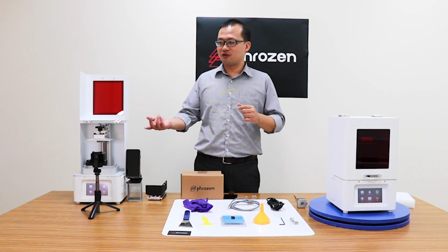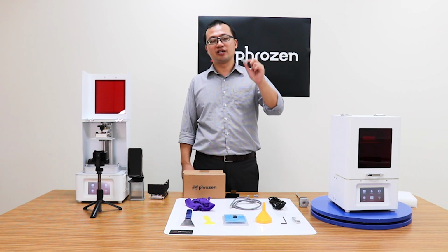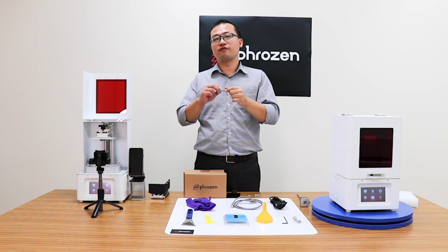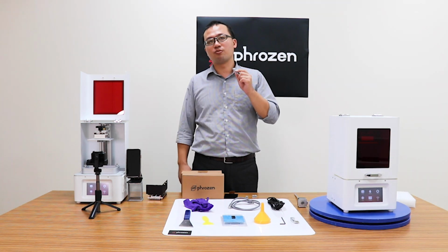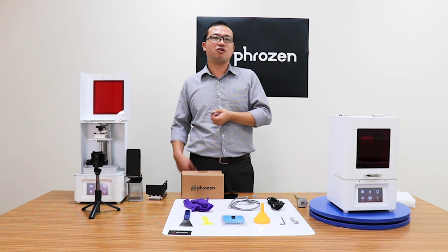Actually, it is for resin printing, but today we are printing dental models, which is a temporary crown for the dental application. So this is a dental model we printed. It's 1.5 to 2 centimeters with 100 micron layer height, and the print time for each layer is 1.5 seconds. So in total, it takes almost 17 minutes for the overall printing.